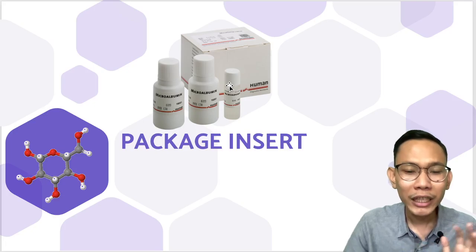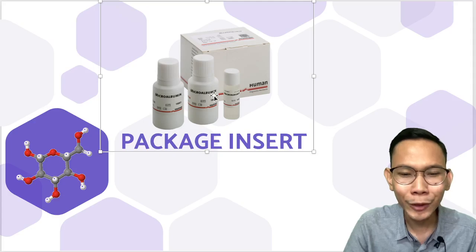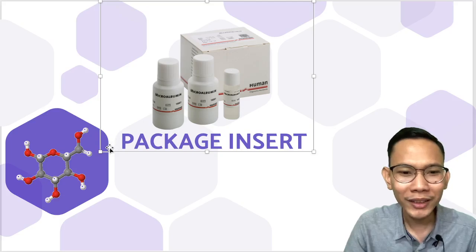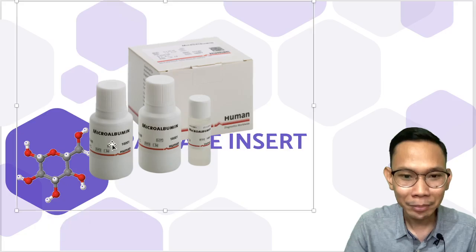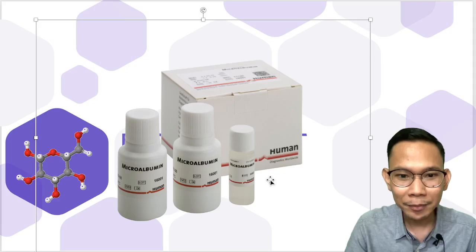Doc, what is this package insert? Again, these are the different reagents. Sorry guys, my example is microalbumin. I couldn't find a good picture for cholesterol, etc., but technically speaking, it's really like this. This is what we receive. I'll make this bigger.